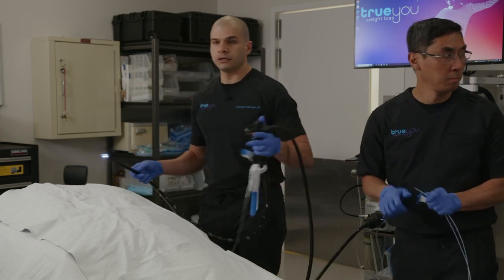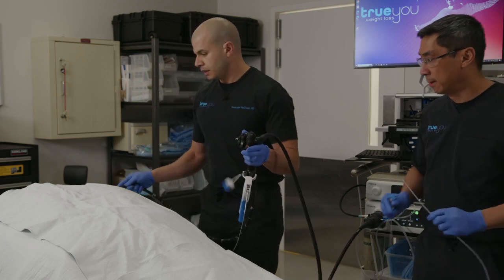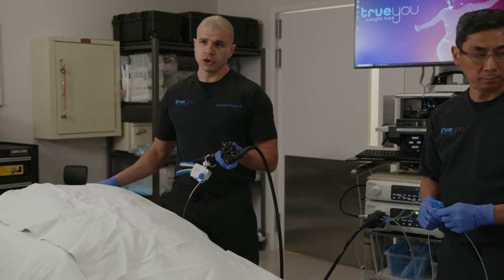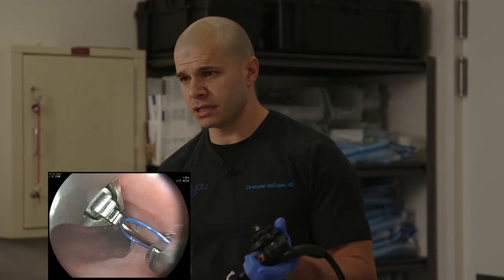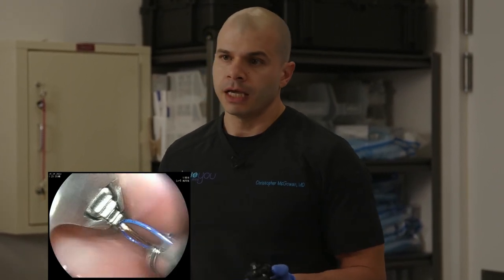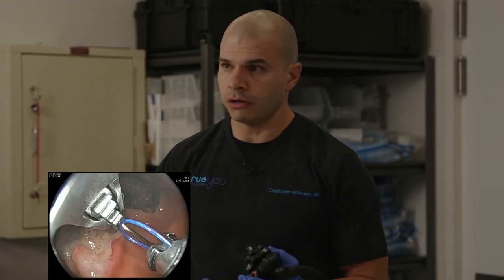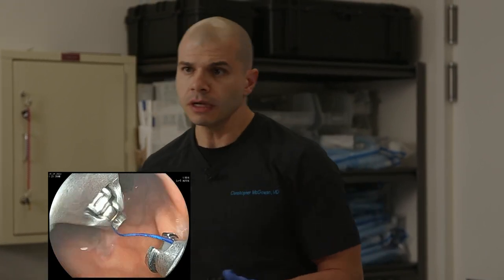So I'm gonna go ahead. What you can see now on the scope view, if that's displaying or not yet, is our dual channel scope. Now this is equipped with our endoscopic suturing system. This is the Apollo Revise device, which is FDA authorized specifically for this procedure in adults with a BMI of 30 to 50. And so this is an endoscopic suturing device. It's the same exact platform or device that we use for the endoscopic sleeve gastroplasty. But in this case, we're using it for this revision procedure.